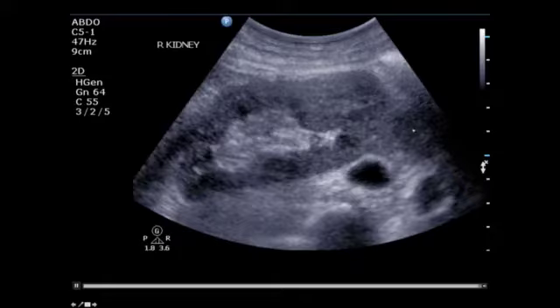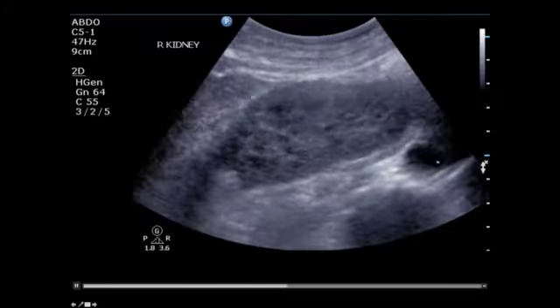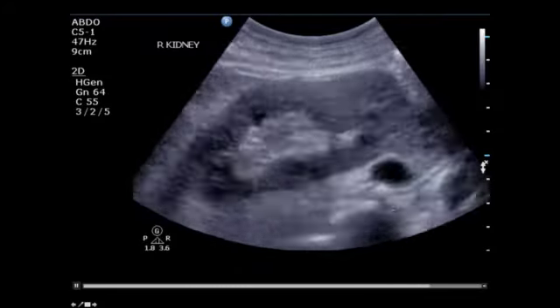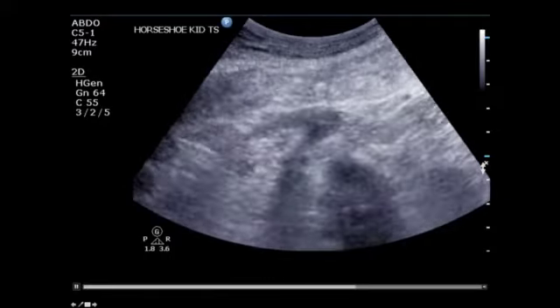And in fact, the orientation of the kidney is unusual. It's lying here in front of the IVC, and there's a vertebral body, and this is aorta here. So the lower pole is going over the IVC and over the aorta. And if I look anteriorly, here's the aorta, and here's that lower pole of that right kidney, and it's coming right across in front of the aorta and joining this left kidney here, and that's a horseshoe kidney.